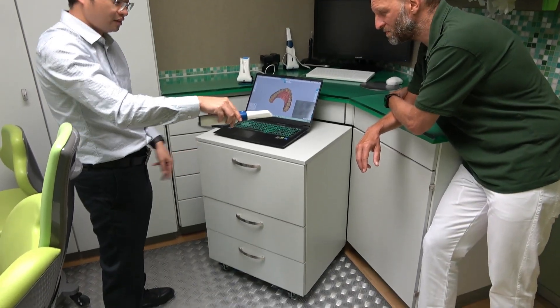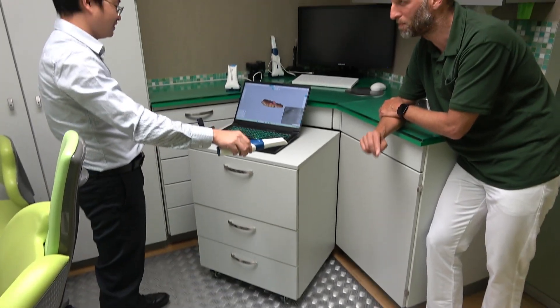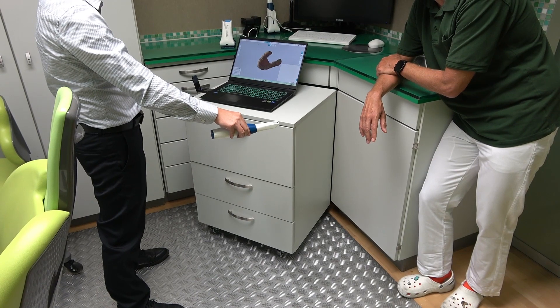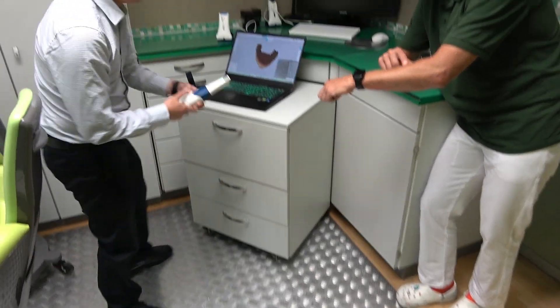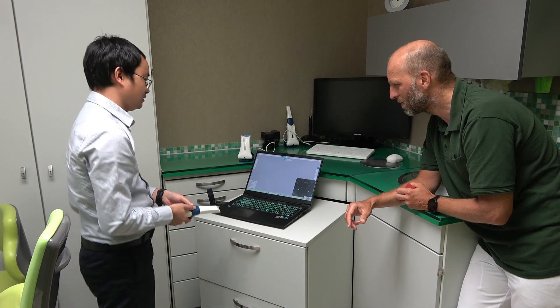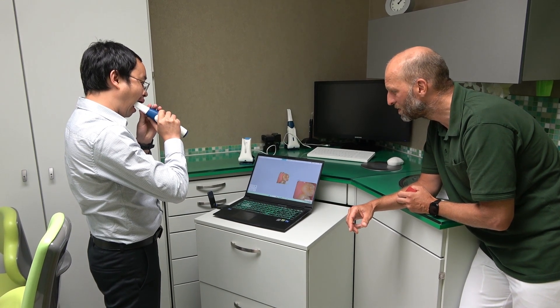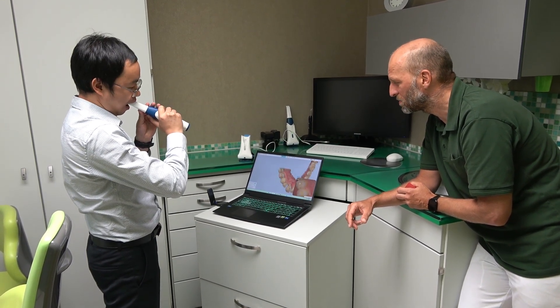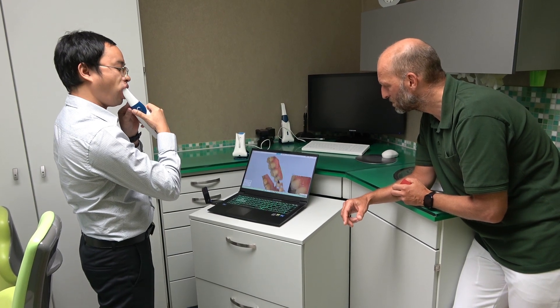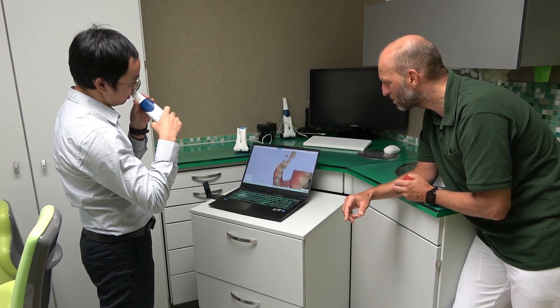You can record the ground, okay? Don't do that at home. Other direction? I did goosebumps. Now — is it still working? Yeah. Thank you.